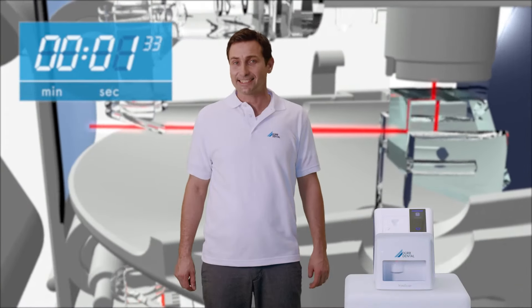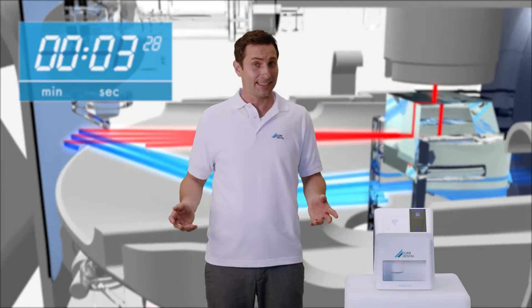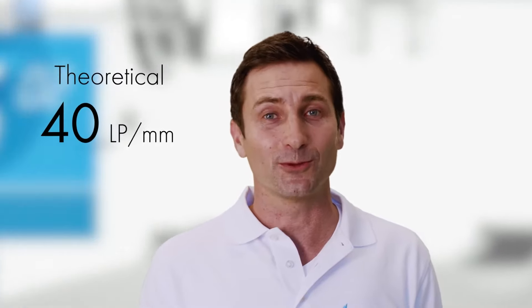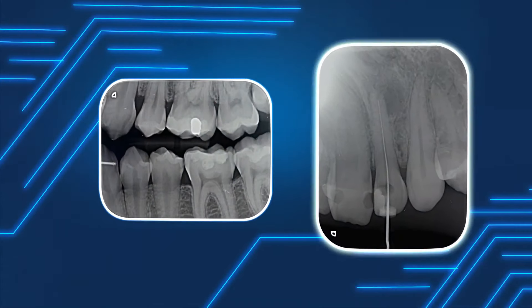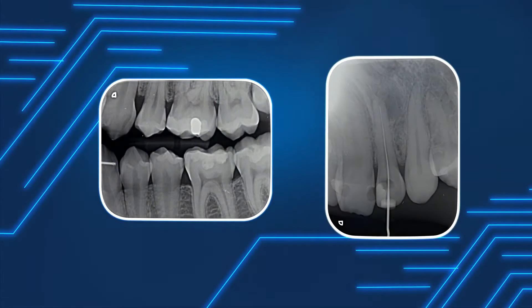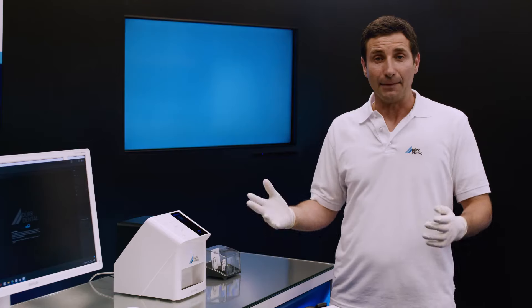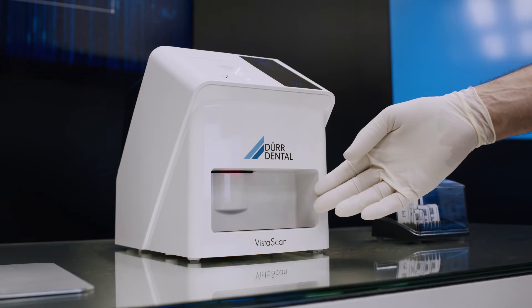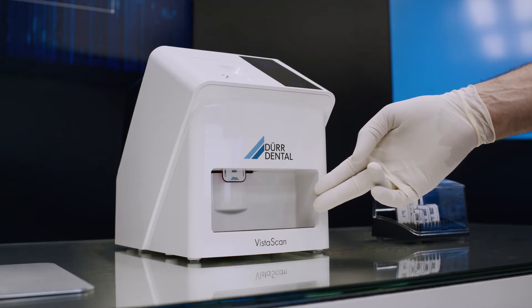Thanks to the PCS scan technology, the VistaScan MiniEasy 2.0 digitalizes the image information on the image plate with an unsurpassed resolution of up to 40 LP per millimetre. As a result, both early stages of caries and endodontic instruments can be reliably displayed and depicted. The image plate is erased automatically at the end of the scanning process, so it is immediately available for the next patient.